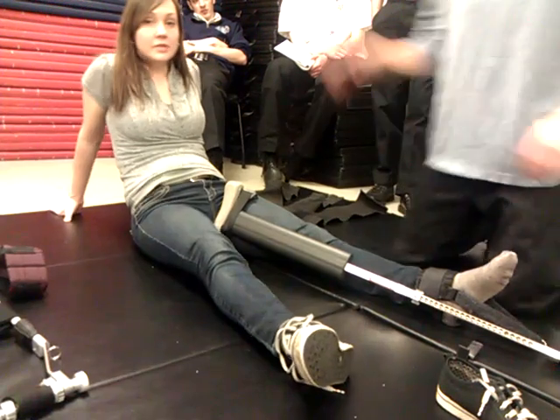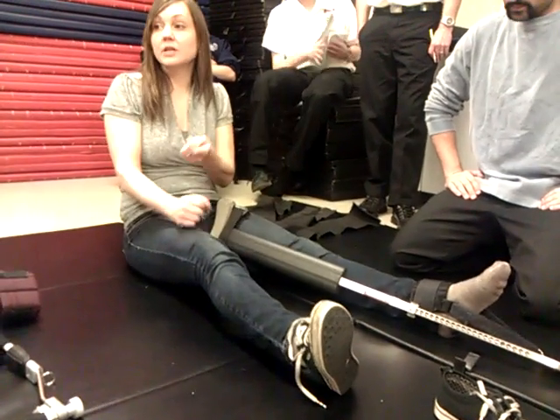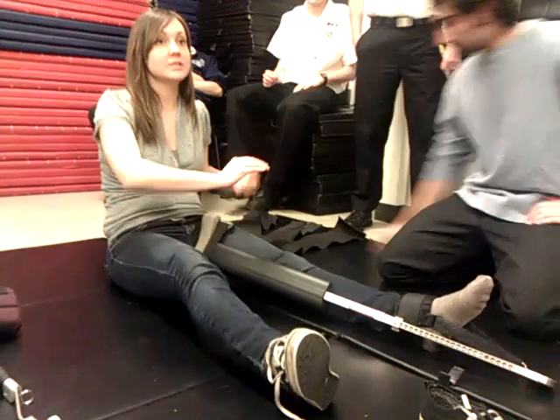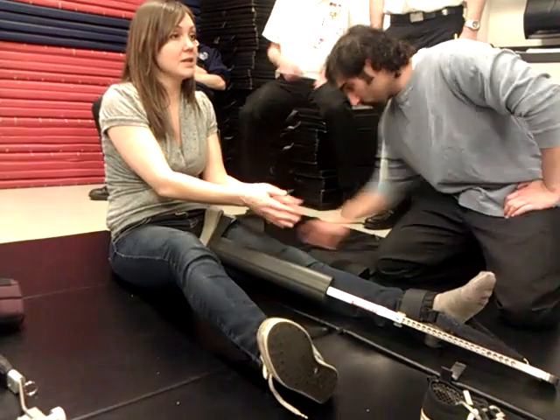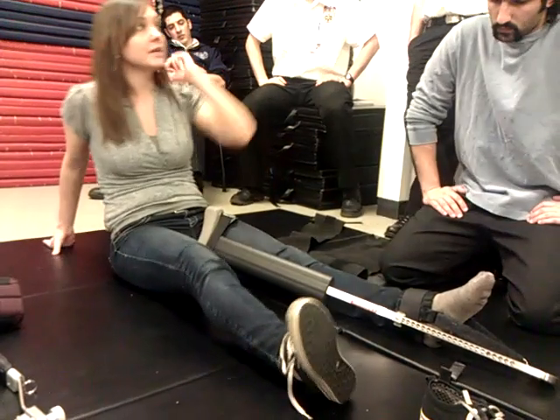If you do feel like you're going to have to jostle the leg or move it at all, be sure and tell your proctor, I have my partner stabilizing so that we can make this very minor movement to accommodate for this. But again, if your invisible partner isn't talked about, then they won't exist.